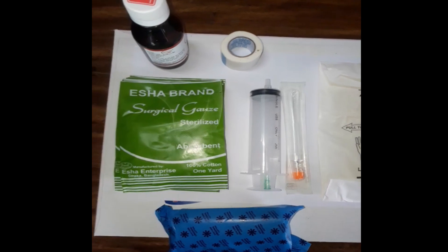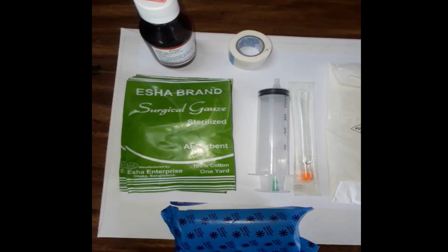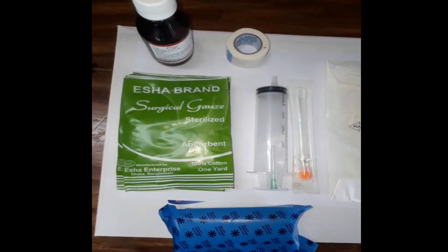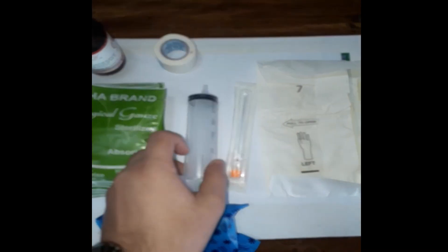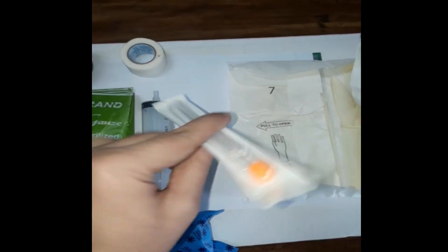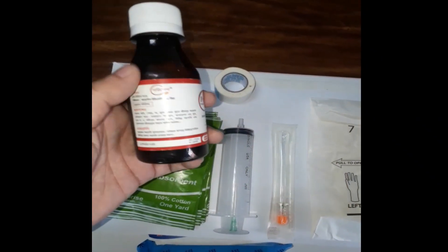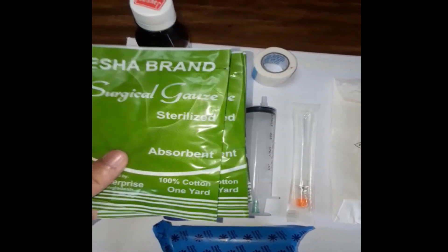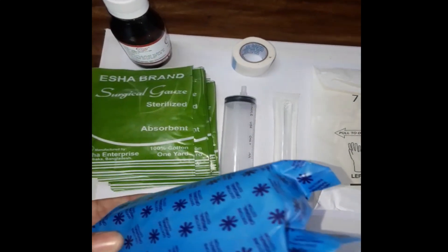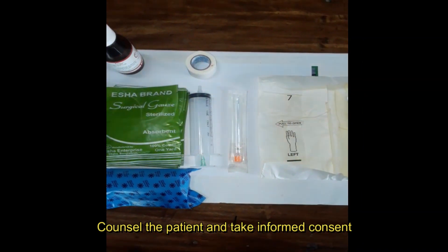Hello, Assalamualaikum everyone. Today we will learn how to aspirate pleural fluid. First of all, let's see the equipment needed: a 50cc one-time plastic syringe, a 20-gauge spinal needle, sterile hand gloves, antiseptic solution which is povidone iodine, micropore tape, some gauze pieces, and cotton.